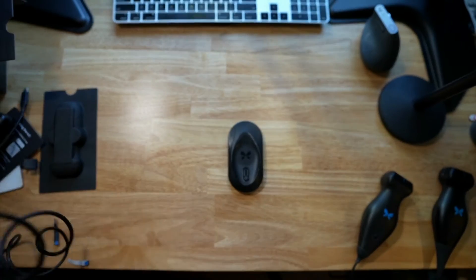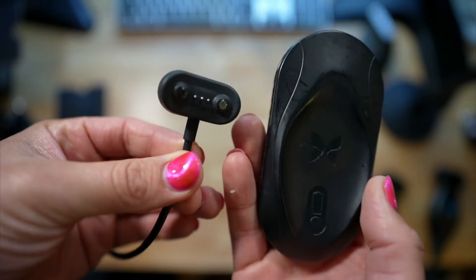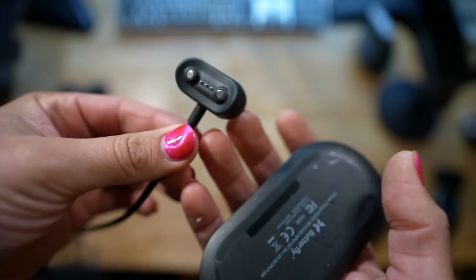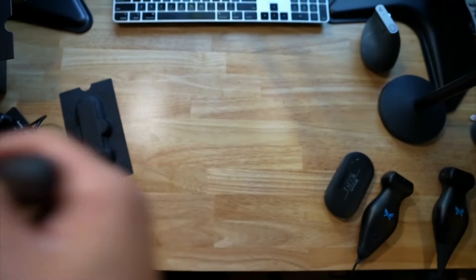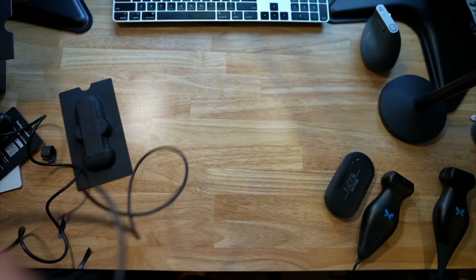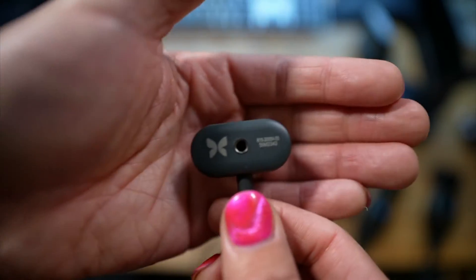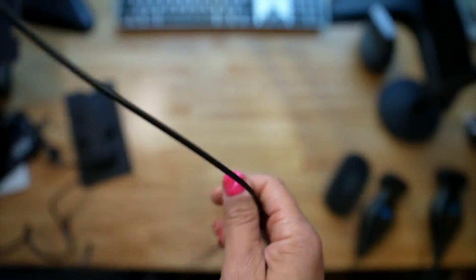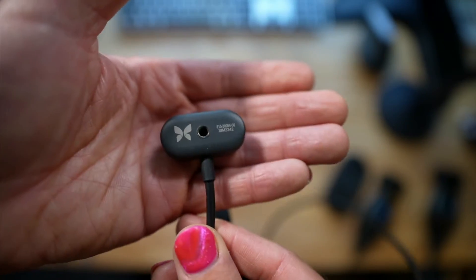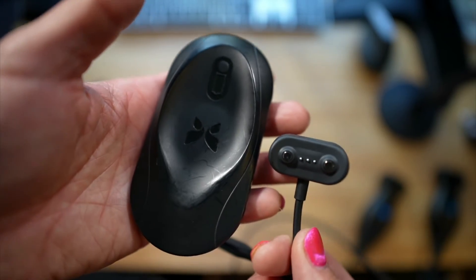Now let's compare that to this little tiny thing. It's a really big difference with the chargers, which I think will make it a lot easier to keep this portable — on shift, in the ambulance, in the OR, in your office. My one piece of feedback is that for traveling, it would have been amazing if it had a USB-C out directly, so I don't have to bring an extra cable. But considering how big the old one was, that's very minor feedback.